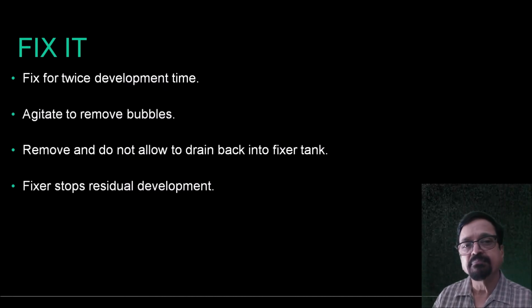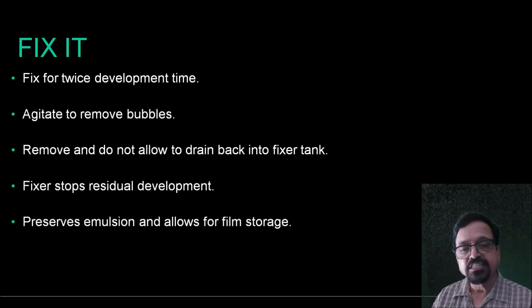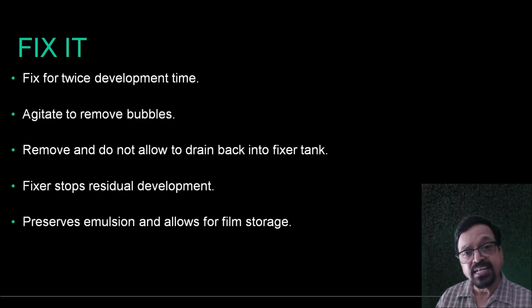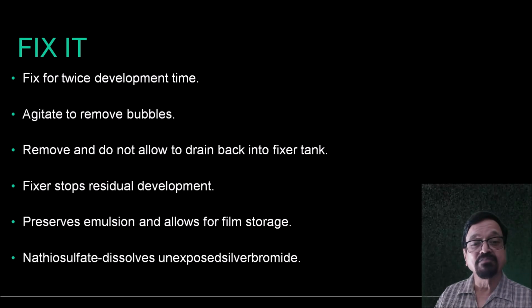One of the basic aims of the fixer is that it stops further development, and the preservatives are there. They allow the film a longer storage. The film should not change its color, it should not fade, and the contrast should not deteriorate. All these things happen only when you have good quality developer and fixer. Not only good quality, the temperature is maintained. Not only temperature, proper agitation is done. Not only agitation, but proper rinsing, developing time maintained, fixing time maintained, and it is properly washed by the water. So these things are very, very important.